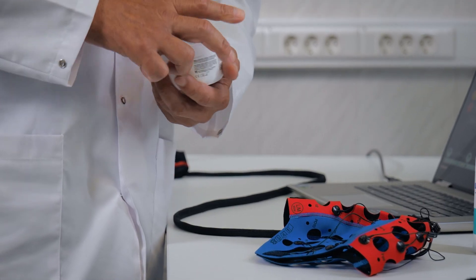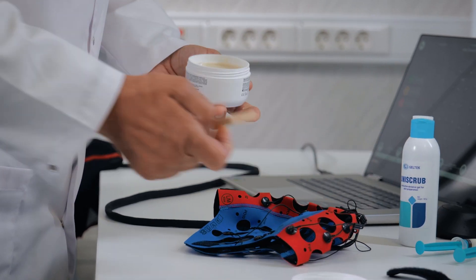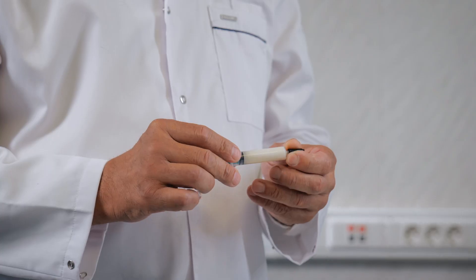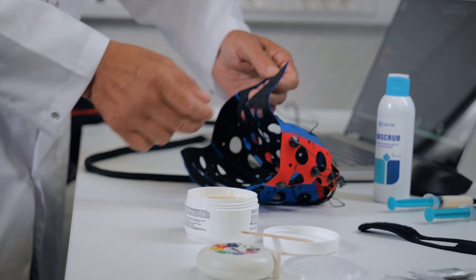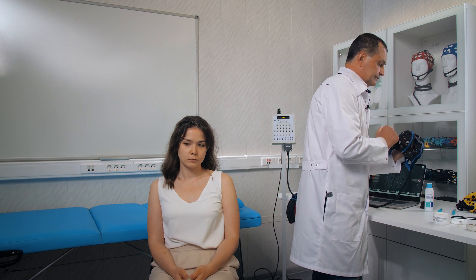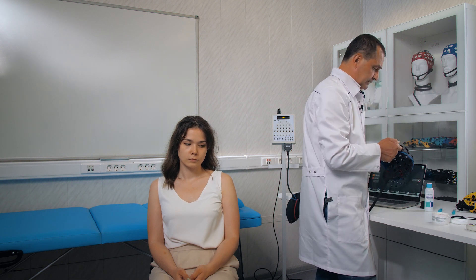Here is the procedure for the installation. We initiate the process by filling the electrodes with paste, ensuring proper coverage and consistency. You can accomplish this by utilizing a spatula, or alternatively you have the option of employing pre-made syringes already filled with paste. At this moment, we will work with a spatula. Make sure to turn the hat inside out, and we fill electrode after electrode with paste, continuously and without pause.